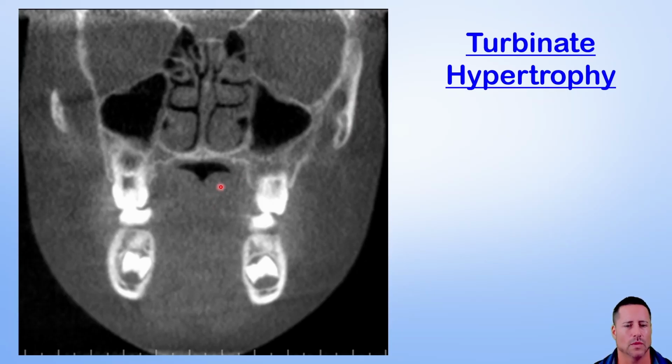But now you're like, ooh, well, maybe that tongue doesn't have enough space, and then they can't breathe through their nose because of their turbinate hypertrophy. And not that we're going into this part right now, but just to extrapolate that, let's look and see, well, maybe that tongue is occluding the airway in the oropharyngeal area. This is how we start to put the picture together to provide a superior service to our patients. And this is where, again, the indirect ROI that we'll be going over a little bit later in this podcast becomes so relevant.